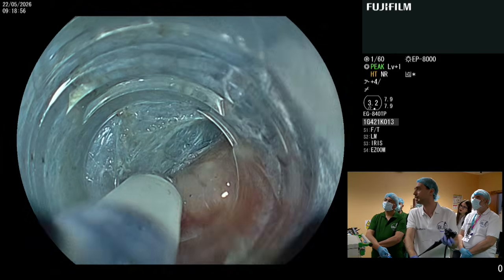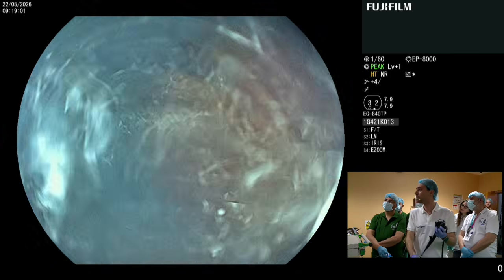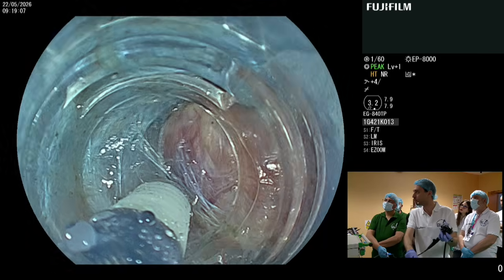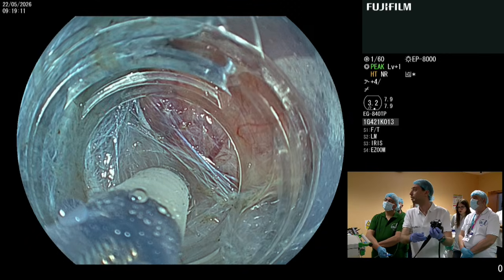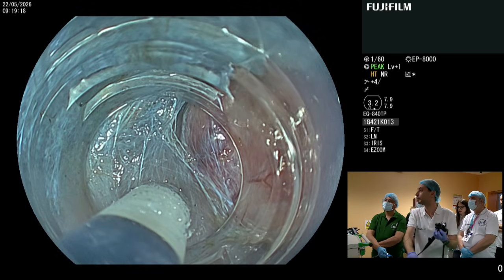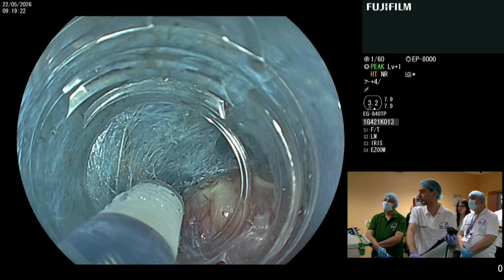it, maybe by surgery. So once the tumor is small, it's safe and relatively easy to remove it by means of ESD or STER. So my point of view is that nowadays, in 2026, it's time to remove these tumors. Only if we have the appropriate training, of course, and that means be experienced in both ESD and POEM.